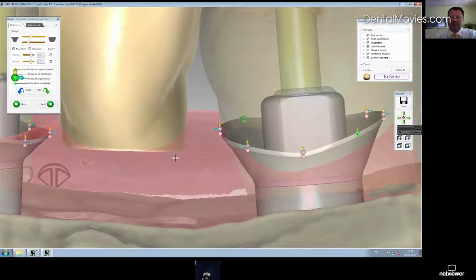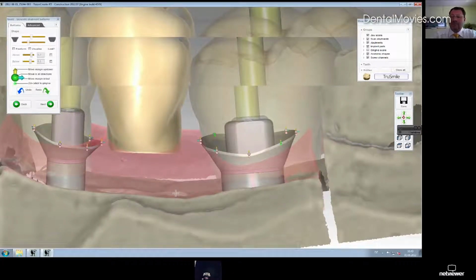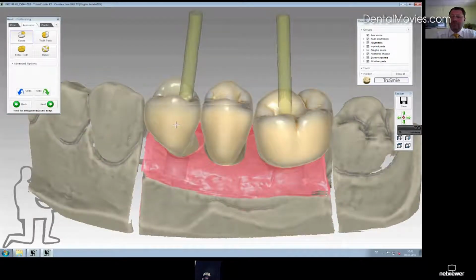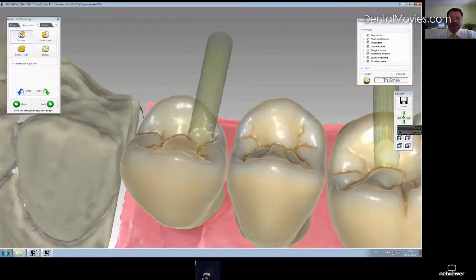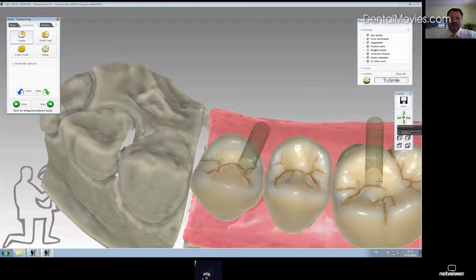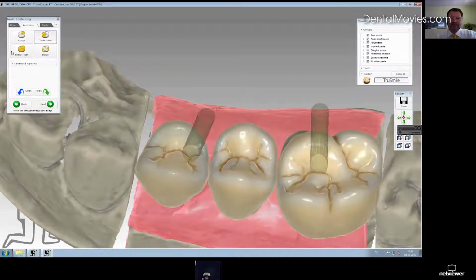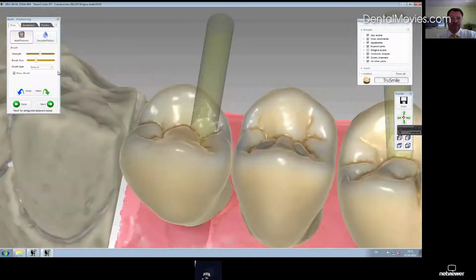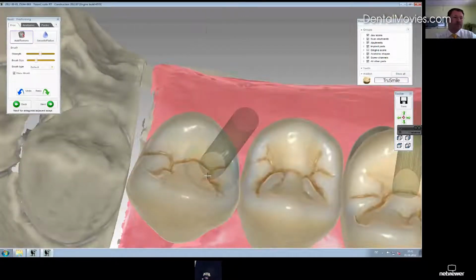And this step is the same for both, but you can choose them individually when you want to. Okay, then the next step is freeforming. You can choose single parts of the tooth and freeform them, or half of the tooth, or the complete tooth.